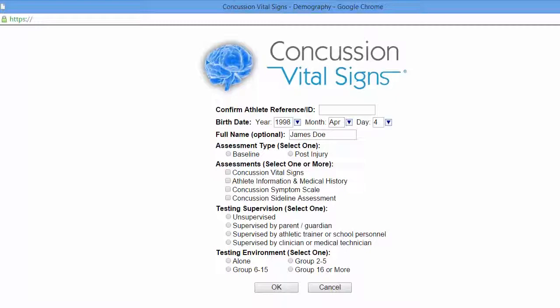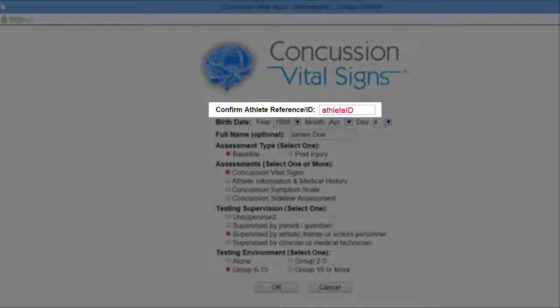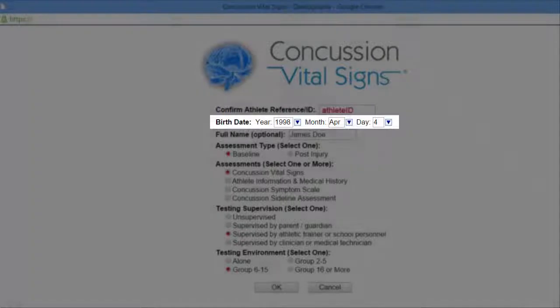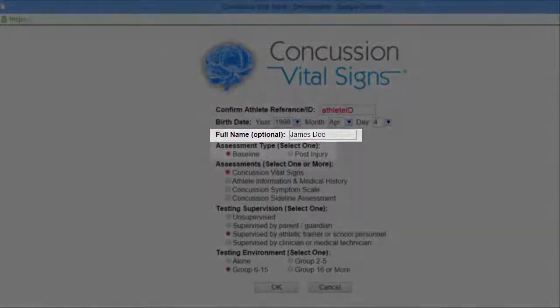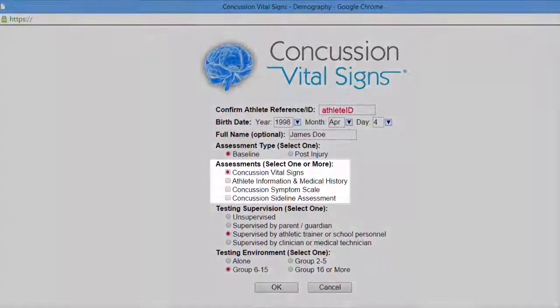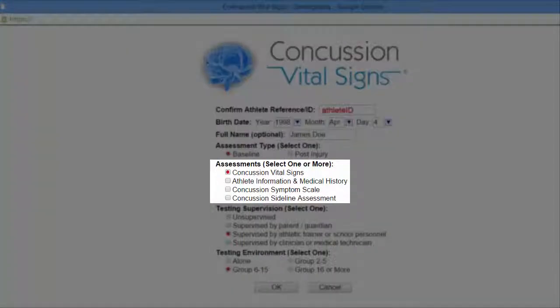You will need to confirm the ID, as well as the date of birth; first and last name is optional. Choose whether it's a baseline or post-injury, and choose the Concussion Vital Signs Assessment. You can also add additional information such as the medical history, symptom scale, and sideline assessment if you would like, or you can just do any one of the four.